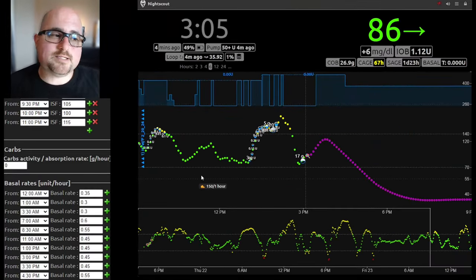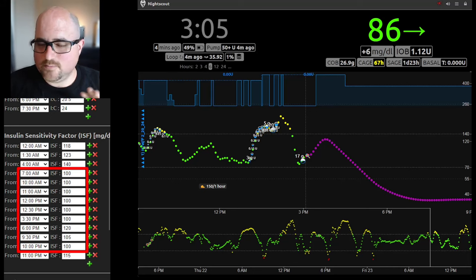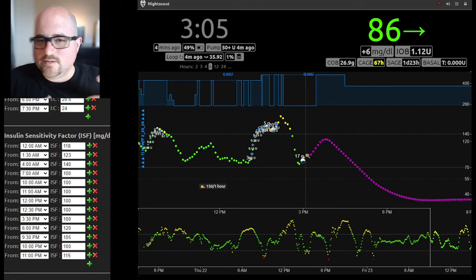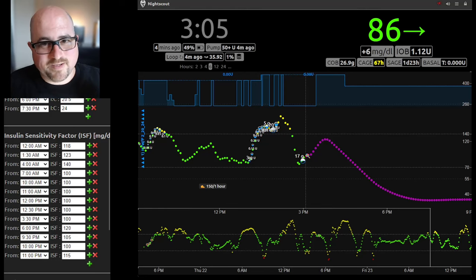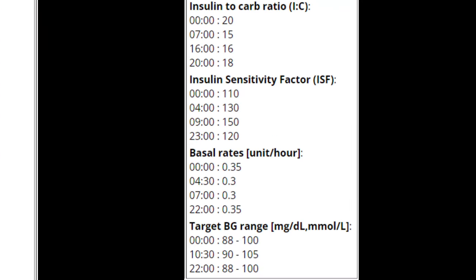That ISF increase — by the way, I'm only talking about the daytime. If you want to keep the nights as low as they are for corrections, in case the basal's too light, that's fine — that's up to you. But I meant more like the awake time. I would also simplify your life — this is a big recommendation. You have a lot of settings here. I tend to go with like two or three two-to-three-hour chunks overnight, and then daytime. Awake time, eating time, food-in-your-face time is one ISF — just make it one. That way you're just adjusting one thing. ISF affects food, so just make one ISF for the day and then a couple at night. That'll dramatically simplify your settings and you're not chasing stuff quite so much.